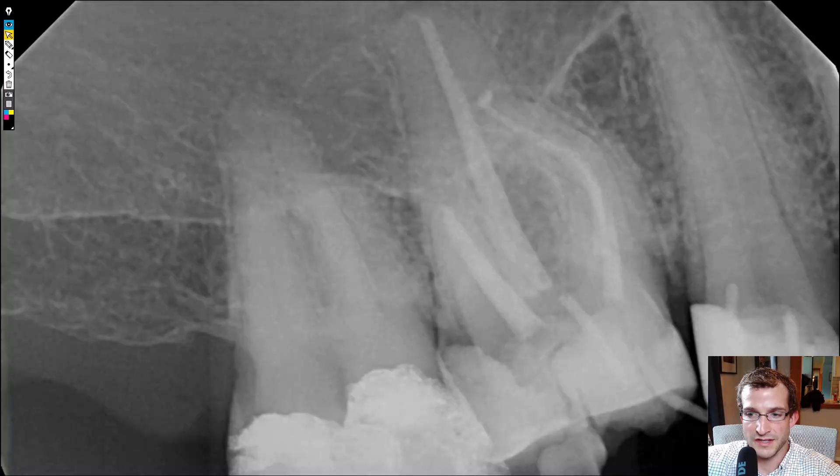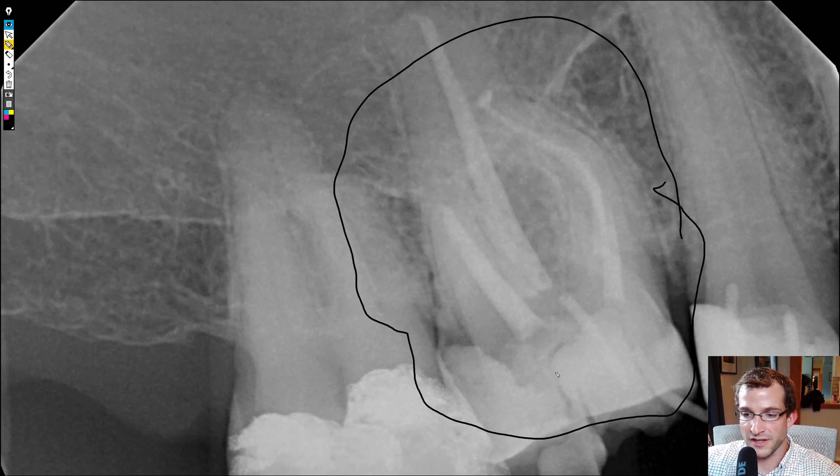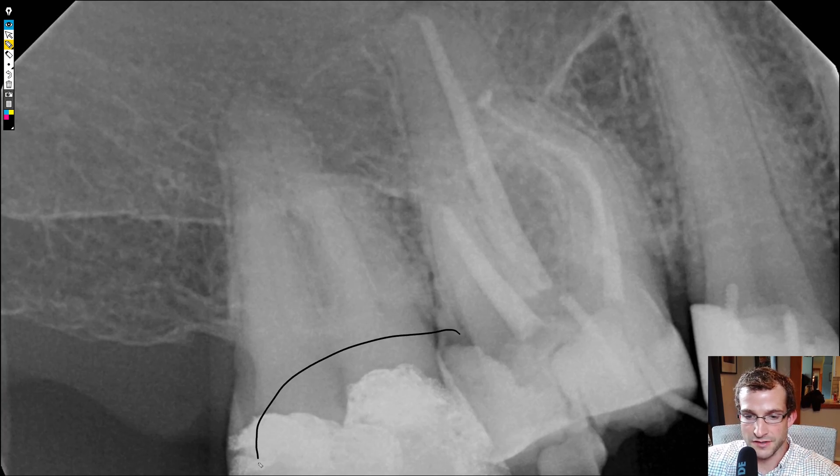So here's the case. The patient had a previously treated 1-6, and it had fractured off at the crown, so it's unrestorable at this point. The only thing we can do is extract the tooth. We actually planned for a bridge in this case due to the size of the restorations on the 1-7 and the 1-5, so we'll get coverage for those teeth and replace the missing 1-6 all in one go, as opposed to doing an implant in the 1-6 site.